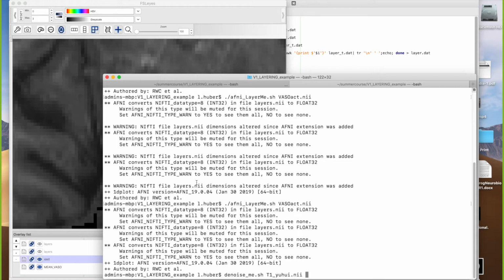I think in FSL, do you have FSL? Farouk, do you know the FSL ROI extraction command? You know what? I would have done it with scripting, basically. Maybe this might be something that we can show next time. Other ways of extracting the profiles. Maybe we should just write a LAYNII program for it. Yeah, that's right. Maybe. But also plotting, you mean? Oh, no, just for extracting, right? Right, for extracting. I wouldn't want to touch the Qt or X11 or so. Yeah, just on writing a CSV file, for instance. Yeah, that's actually a good idea. Yeah, let's do that.